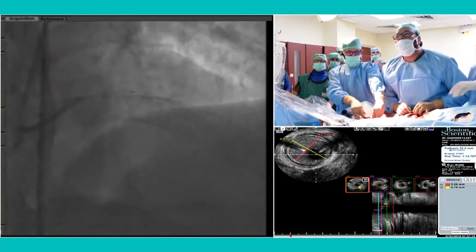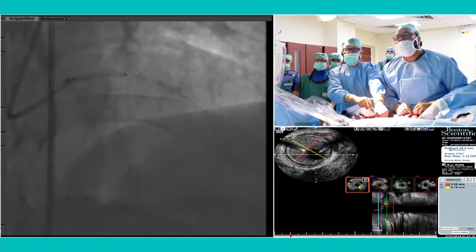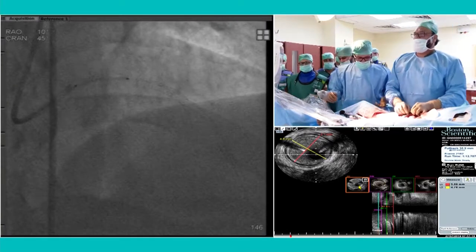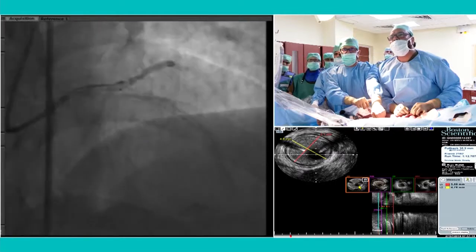So you are putting a stent into the LMCA only for doing a POT, right? No, there's a distal left main 67% plaque. So there is the ostioproximal part of the LMCA, which is 3-4 millimeters. There is no disease. That is why you are avoiding a stent there.